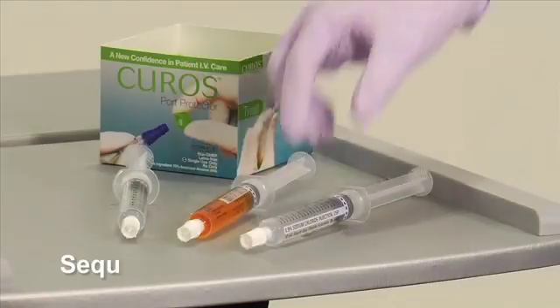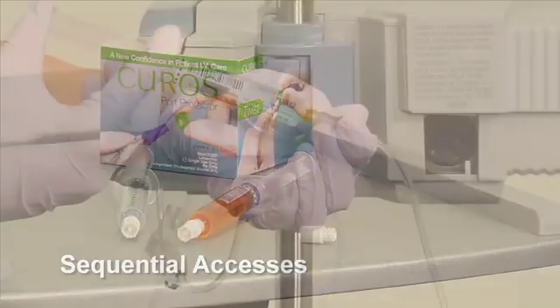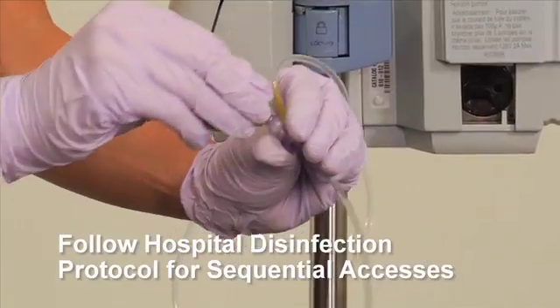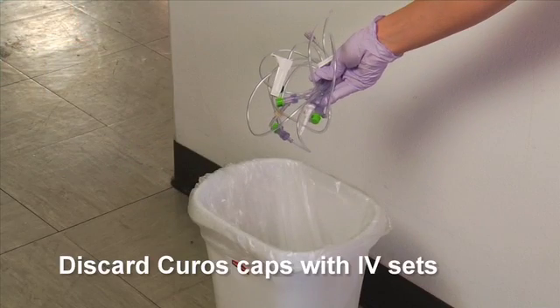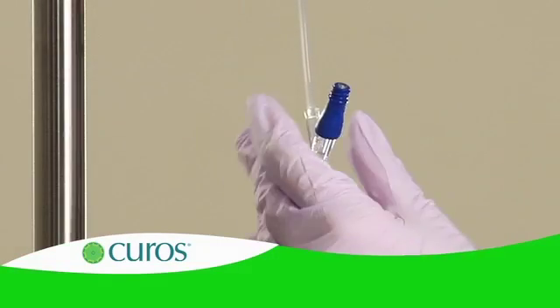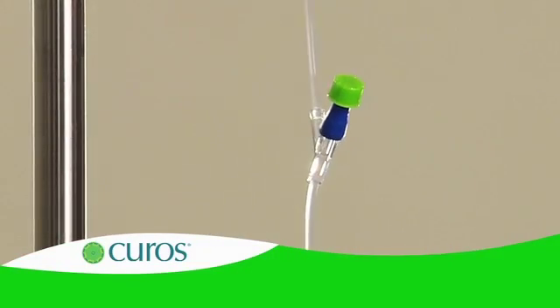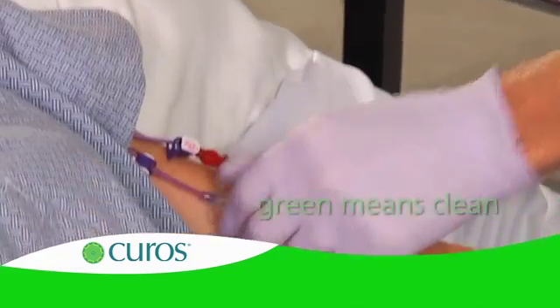If there is any visible soil on the needleless connector after access, perform a swab procedure to remove it before putting a new CUROS into place. If you are performing sequential accesses such as a saline flush, medication push, or saline flush, please follow your hospital disinfection protocols. When IV sets or needleless connectors are removed and discarded, CUROS caps should be discarded along with them in compliance with hospital protocols. With CUROS, evidence of protocol compliance is immediately visible and easy to assure — with CUROS caps in place, green means clean.